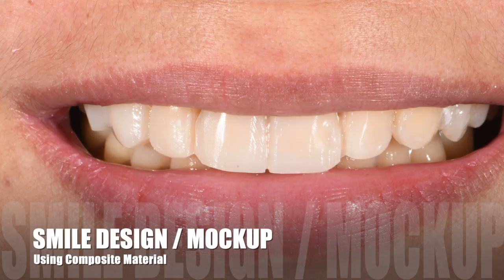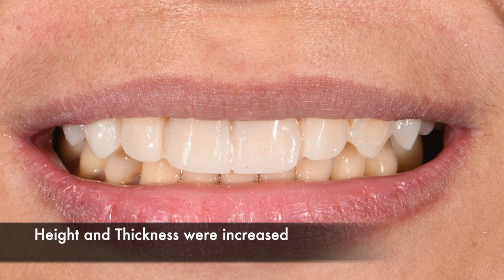She's actually afraid of the procedure na veneers. Baka it might look fake and something like that. It might not be an advantage sa part niya. So we did a mock-up directly in the patient's mouth to be able to check the design na gusto niya. So I increased the height, I increased the thickness, I made sure that I balanced everything.